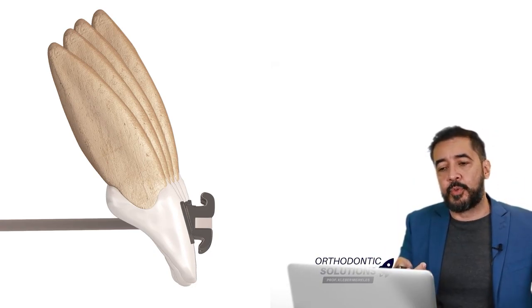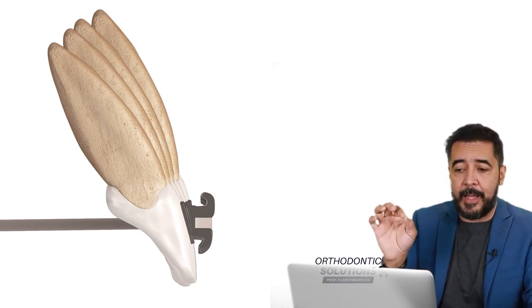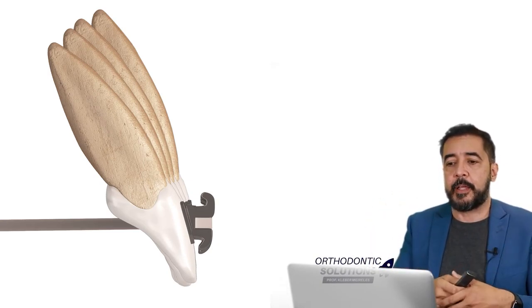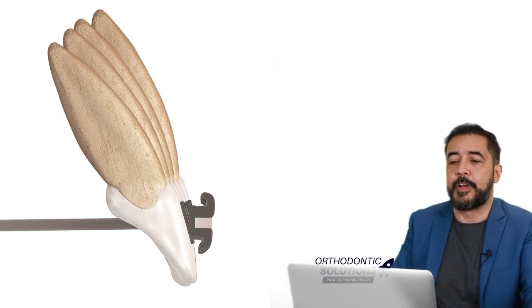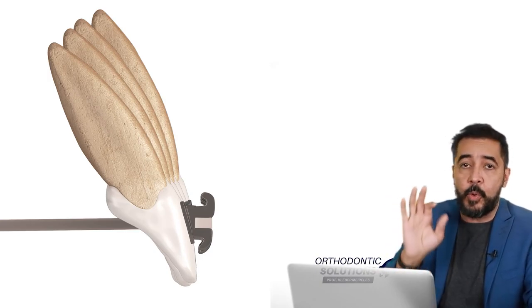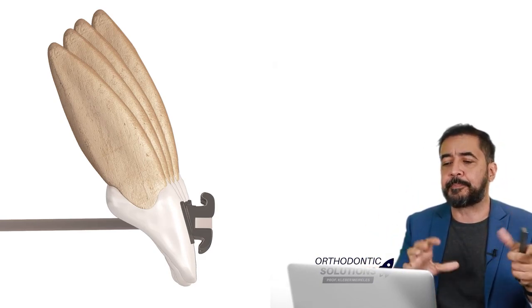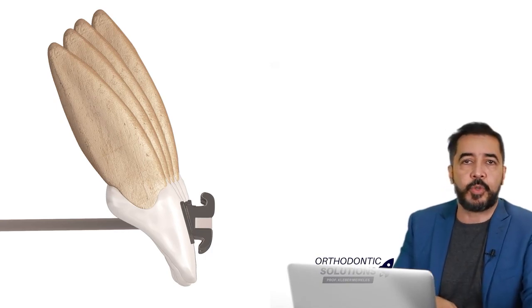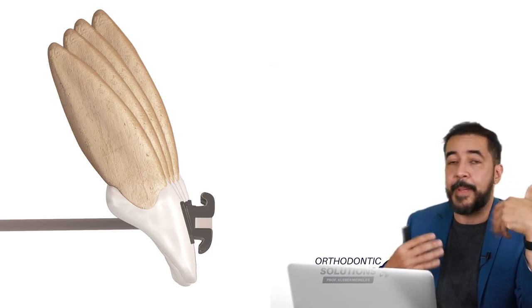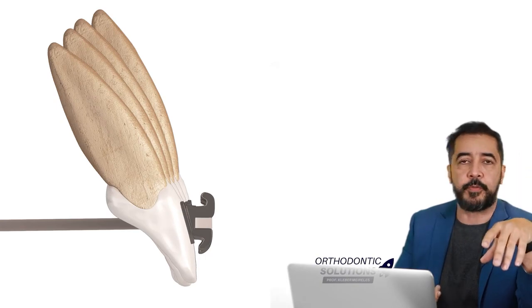So we try to do fewer bends, and we try to lower our treatment time with the patient in our chair, lowering also the need for doing torques and bends and loops wherever it needs. So we're trying to save time in our treatment by using the right prescription, the right torque, and the right positioning of our brackets. So we don't need to do torque and bends all the time, because we did the correct positioning, and we chose the correct prescription for those patients.